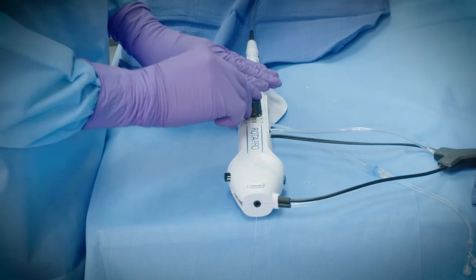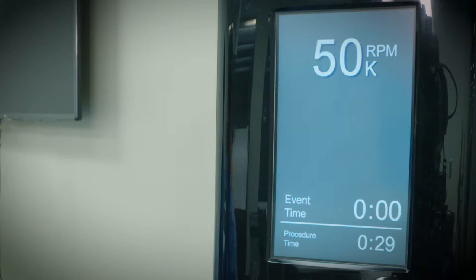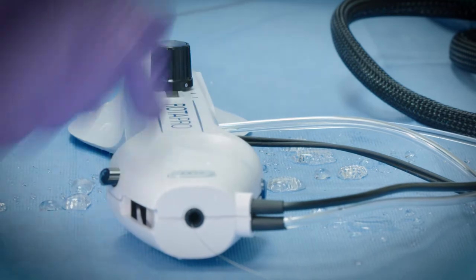Turn on rotation by pressing and releasing the advancer knob button. Allow approximately one second for rotational speed to stabilize. Advance the burr and complete the case using proper technique.